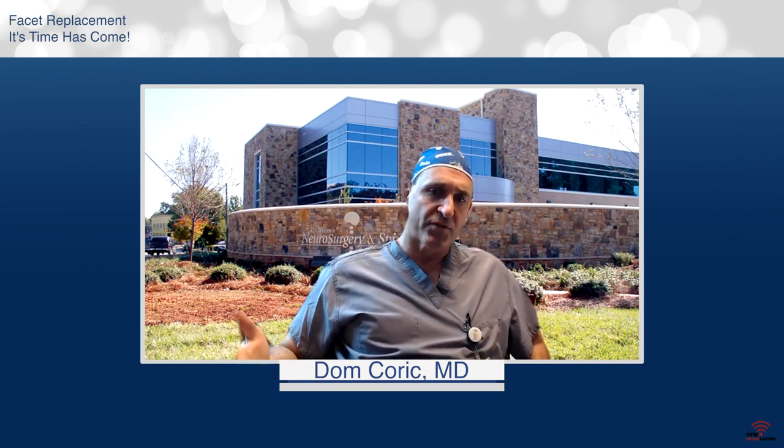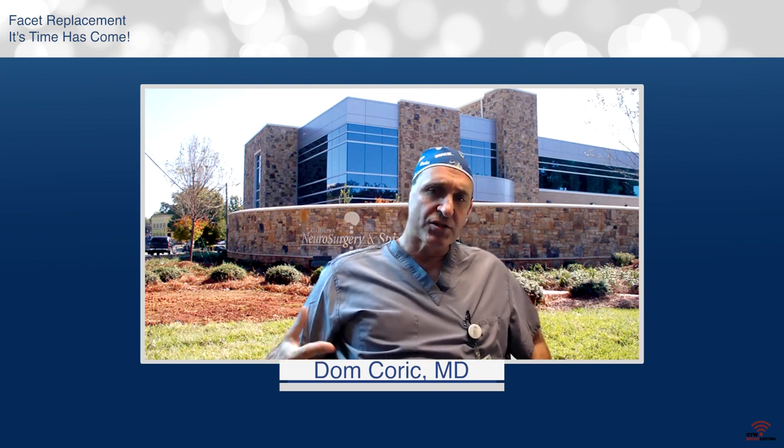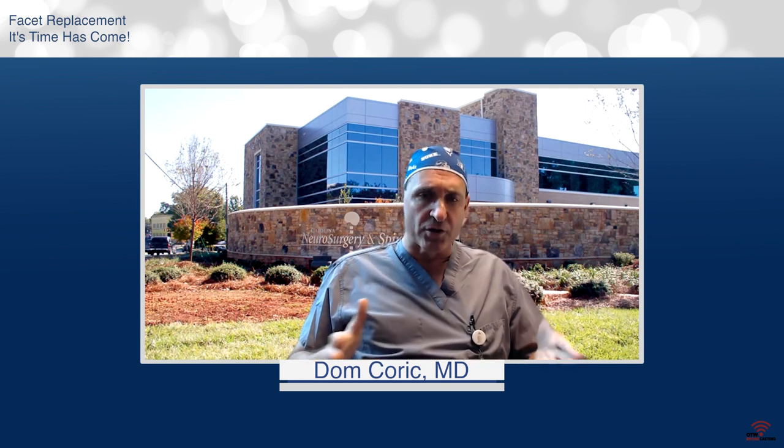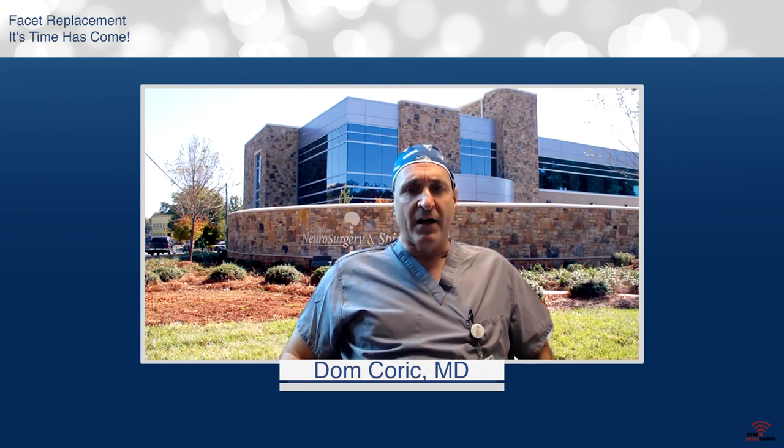I would say, and I think that the IDE data bears this out, Robin, that it is very similar to standard TLIF, and the analogy is artificial disc versus ACDF. With cervical artificial disc, you have to pay a little more attention to symmetry and nuance, and it's the exact same thing with TOPS. It is a familiar, straightforward workhorse approach to the posterior lumbar spine. It's an open approach, so you have all the anatomy laid out. You want to make sure that you really have that wide decompression. And in terms of the pedicle screws, you want them as long as they can be, and you want them symmetrical. It is really just a matter of paying attention to nuance.